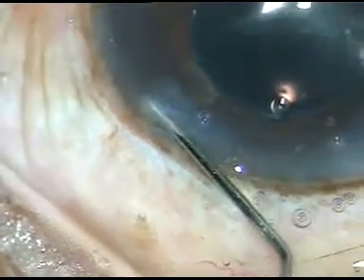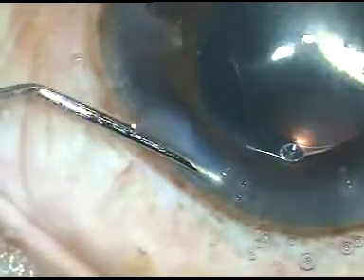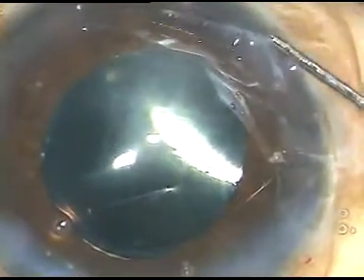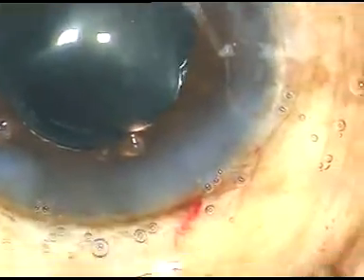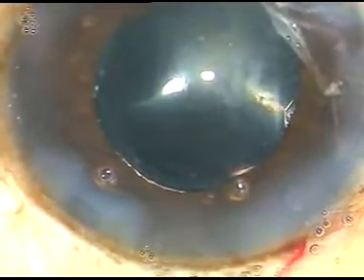Now I hydrate the side ports. I don't hydrate my main incision. In 99% cases, it doesn't require any hydration. And now the anterior chamber is to be formed nicely. This is a view under higher magnification.